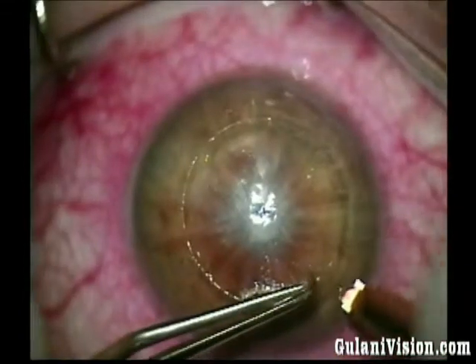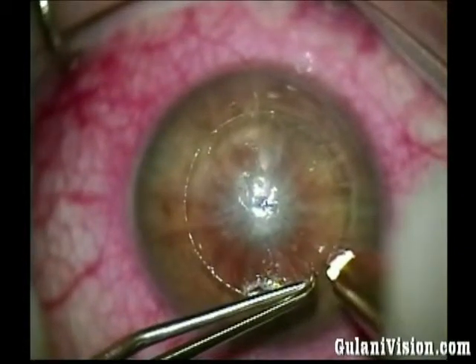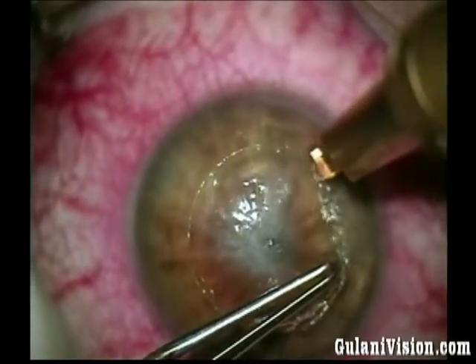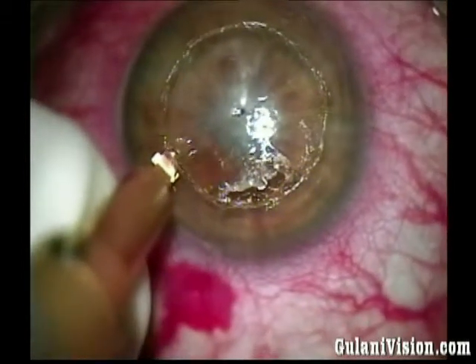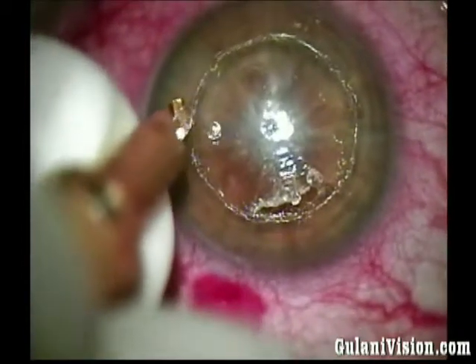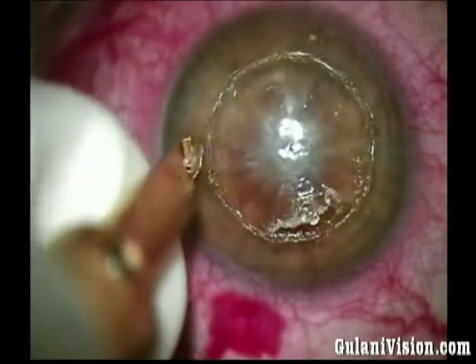As I see the arcuate incisions coming apart, I decide to use a diamond blade set to 200 micron depth and go in my track of the trephination — not giving up on lamellar surgery and not converting to penetrating, keeping my promise of elegance following corneoplastic principles.